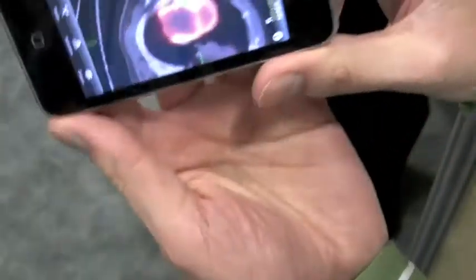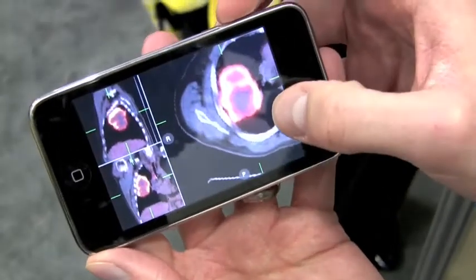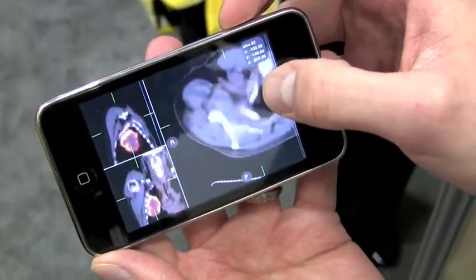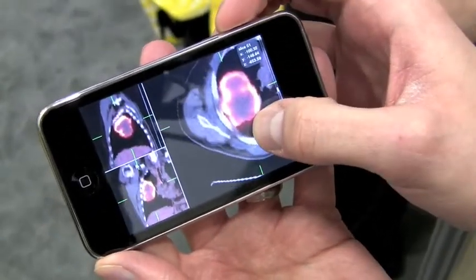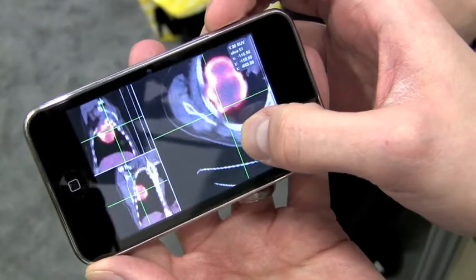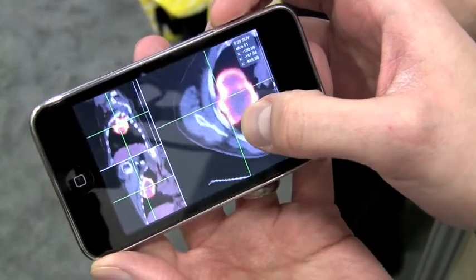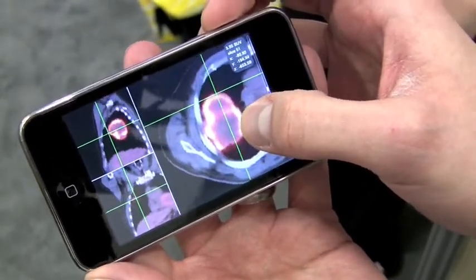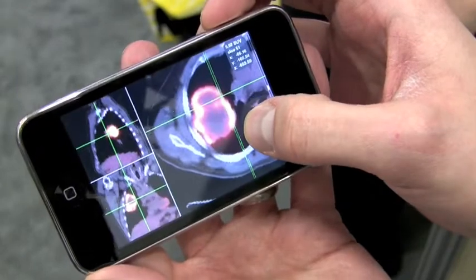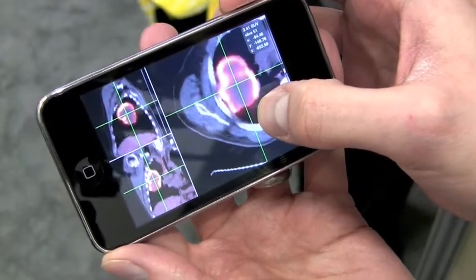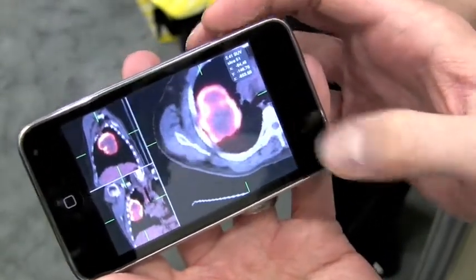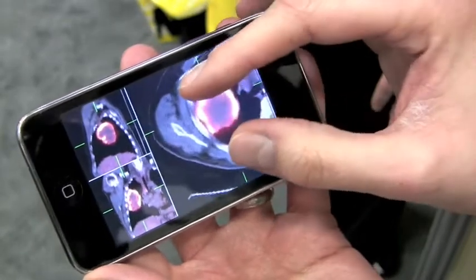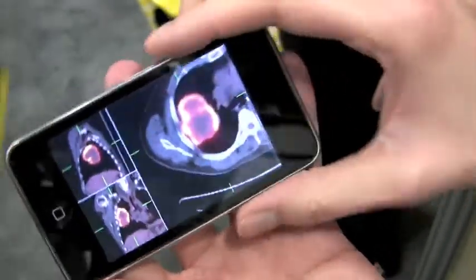If we turn the phone on its side, you can see all planes at once, and this is all being rendered live on the device. We can change the localization point, so a physician could interrogate certain voxels or pixels to see what the value is there. And we can still pinch and zoom from here.